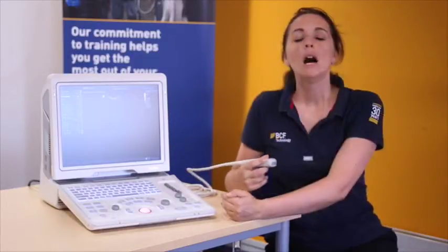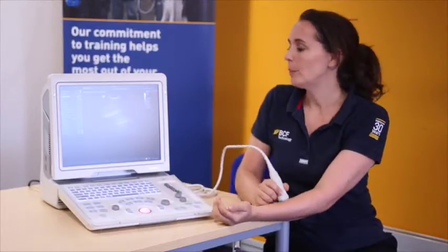Now we have our patient details in, we're ready to start scanning. I'm just going to go through the basic buttons that you should use for any scan. I'm going to use my arm as an example.